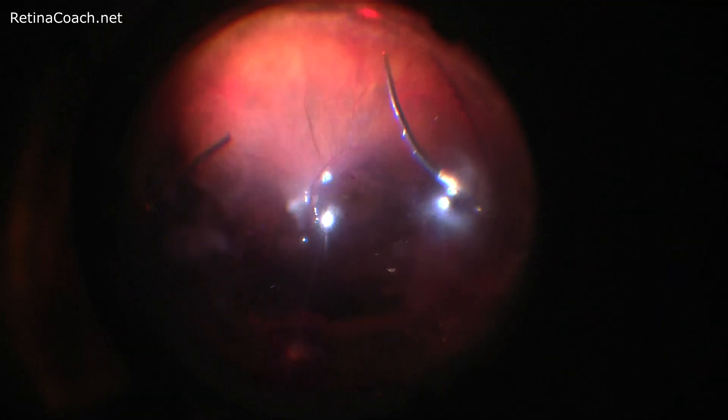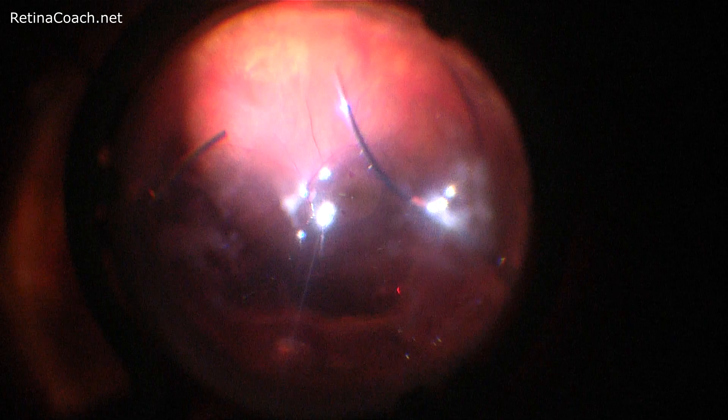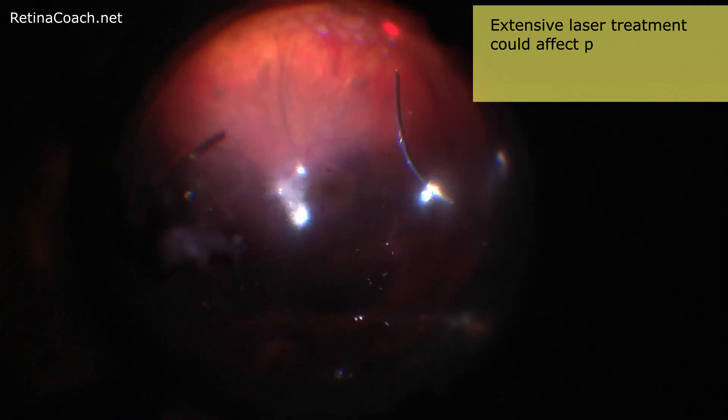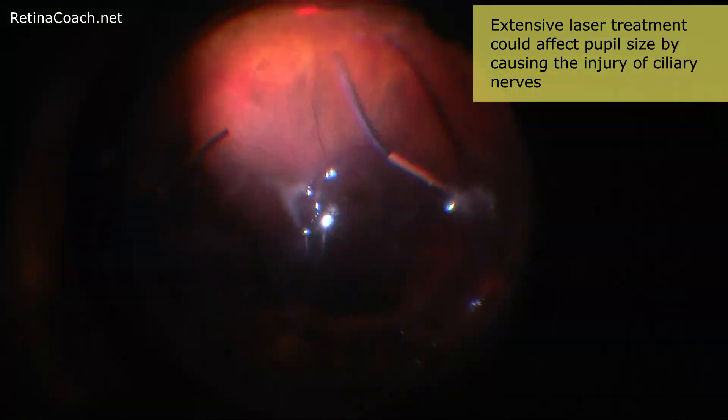Some surgeons prefer intraoperative 360-degree prophylactic endolaser in every retinal detachment surgery. However, several studies showed that extensive laser treatment could affect pupil size by causing injury to ciliary nerves. The choice of laser technique depends on the surgeon's preferences and experience, but there are general principles.